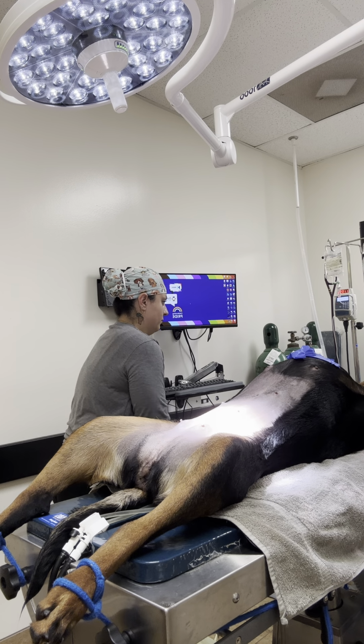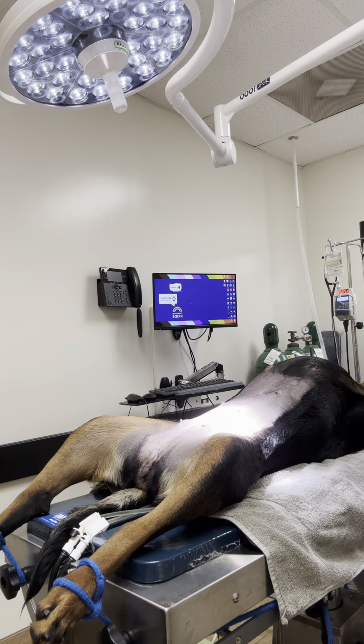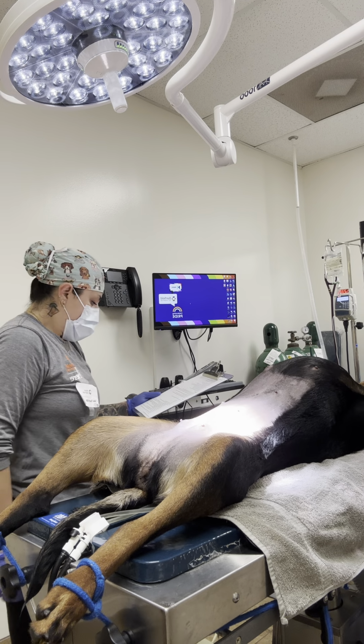What do you think? I am so used to just going off of the map. So I feel like that's a tiny bit high for me, but if you're happy, I'm happy. It's a little high, but knowing that our low is 71, it's not 140, 80. So that gives me a little more breathing room.